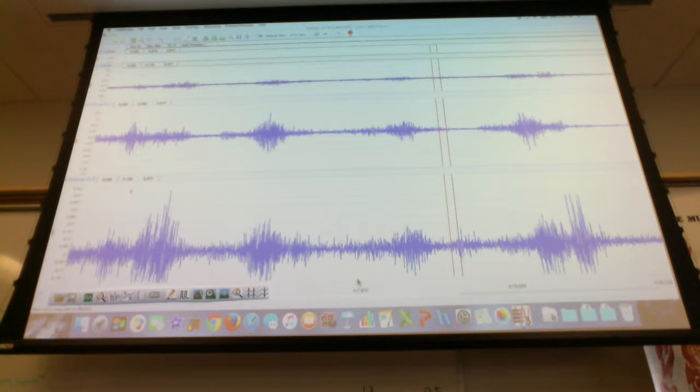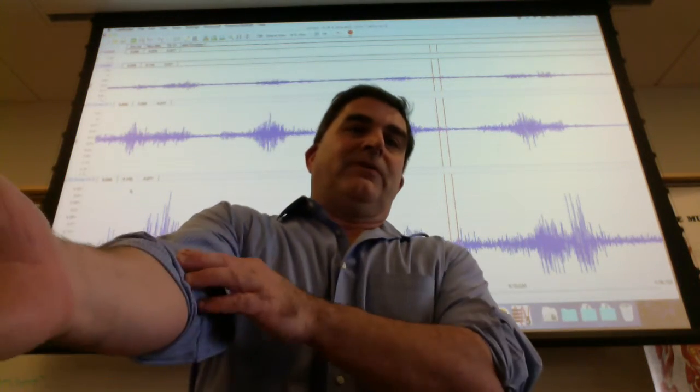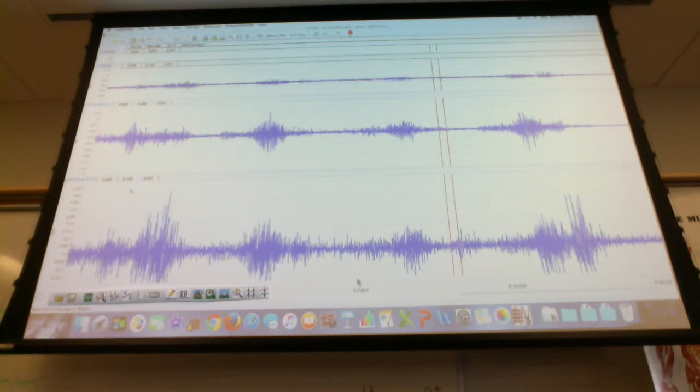What kind of values did you have for the tricep at the same time? Were the triceps active during that time? They were less active, but they were active, right? Okay, so this is a phenomenon that is called coactivation. And so whenever your muscles are moving in a natural way and you're trying to do something, the agonist and antagonist are both going to fire, right?